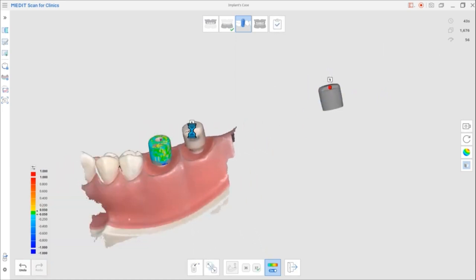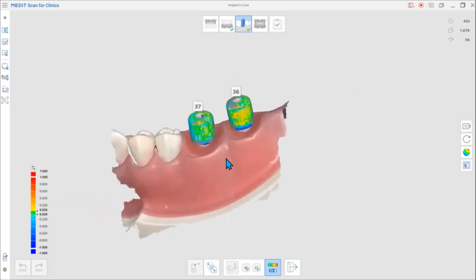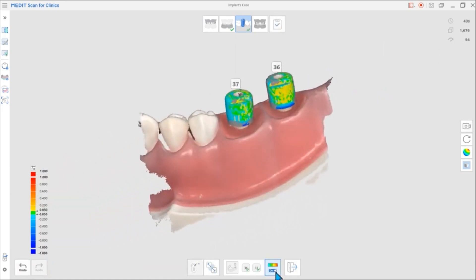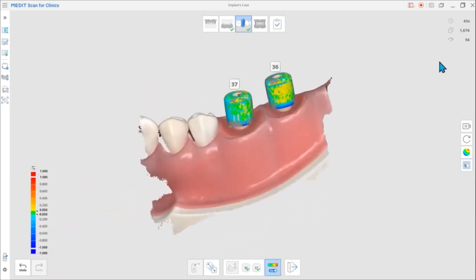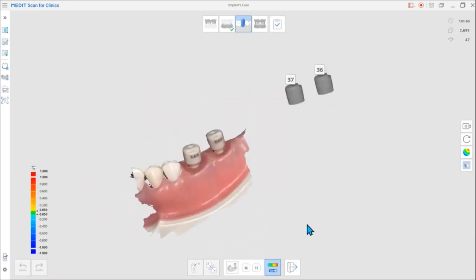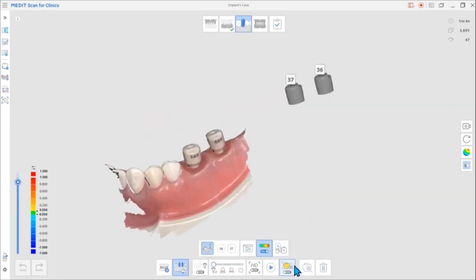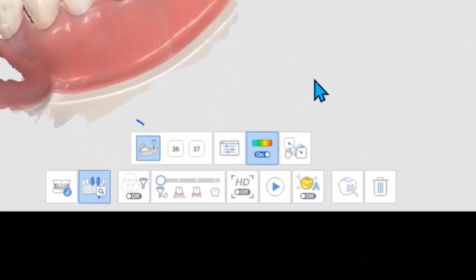You can check the scan data and library's deviation through the color map. If you exit without specifying an alignment point, the screen will show as follows. You can scan additionally by assigning the base or tooth number.